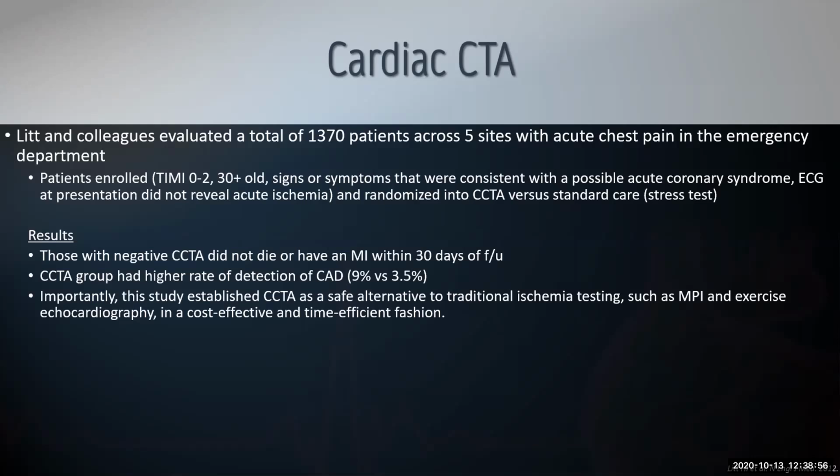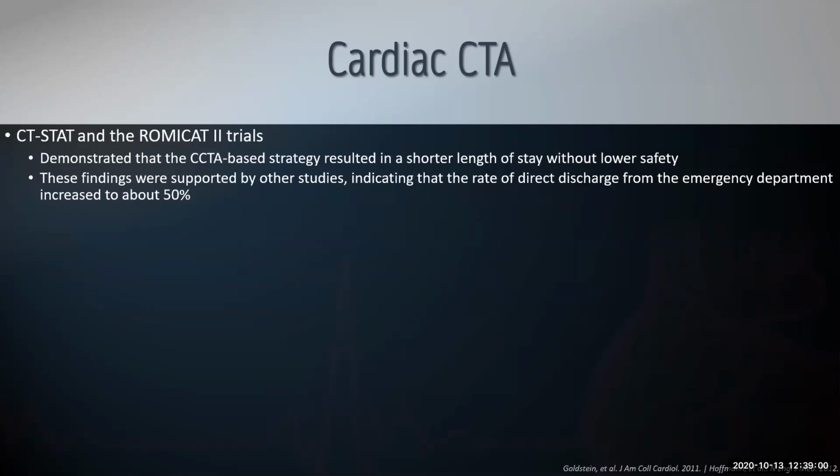But I still think that there are more studies that we need to truly be able to change our overall habits of shifting from functional stress testing to cardiac CTA. I think it's going to happen, to be honest with you.